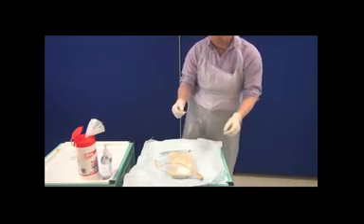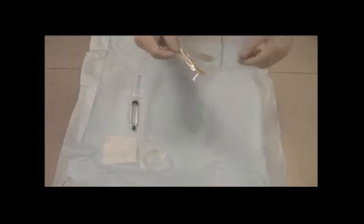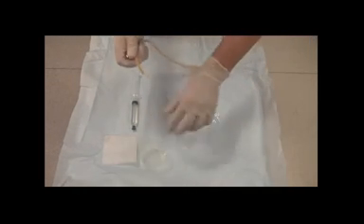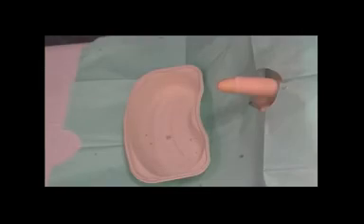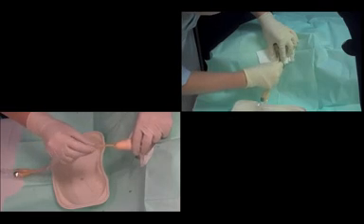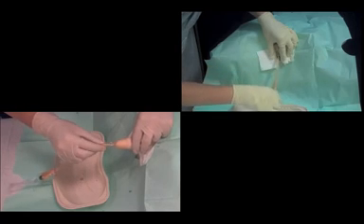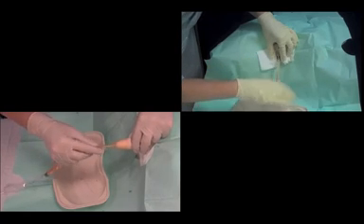When eventually you've put your second pair of sterile gloves on, take the receiver and place it on the end of the sterile drape between the patient's legs. This will be used to catch any urine that dribbles out of the catheter during insertion. Open the water that you're going to use to inflate the balloon on the catheter. Remove the top of the packaging of the catheter and then use a piece of gauze to either hold the penis or part the labia. Insert the catheter into the urethra, making sure at no point you touch the catheter itself, only the outer packaging.